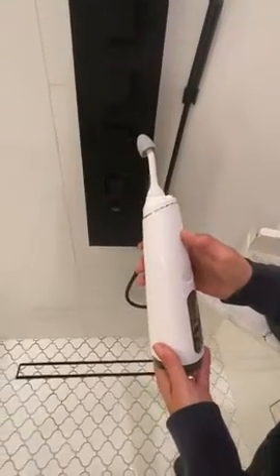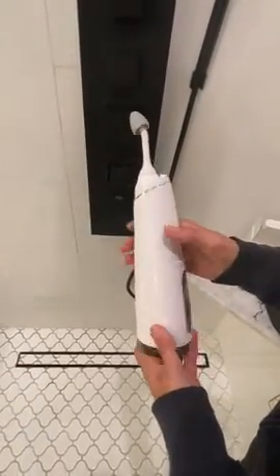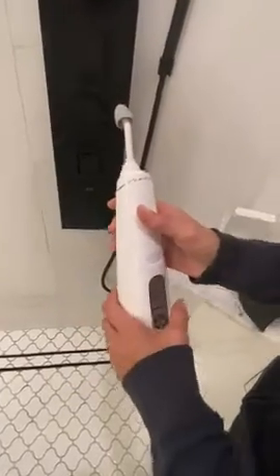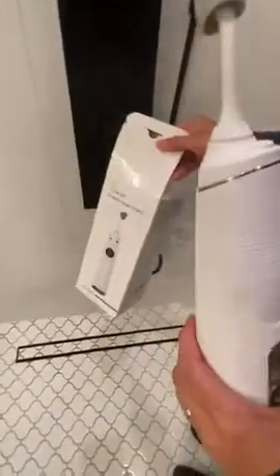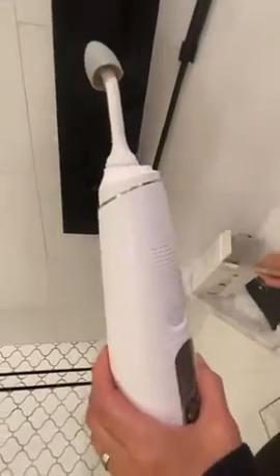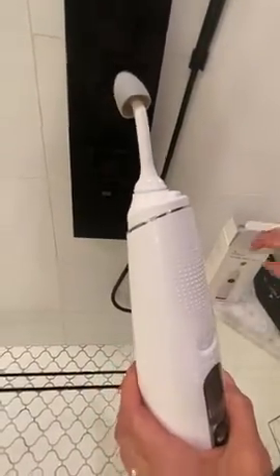This is my review of the Rejoven Portable Nasal Irrigator. It is a very nice unit — it feels like high quality. It comes in a very nice box with a bag, a bunch of irrigation tips, and a USB charger.